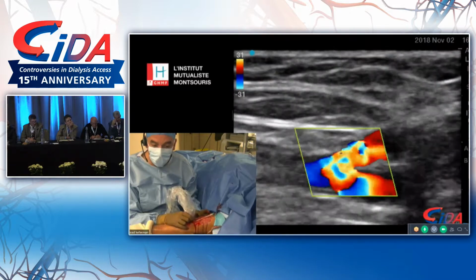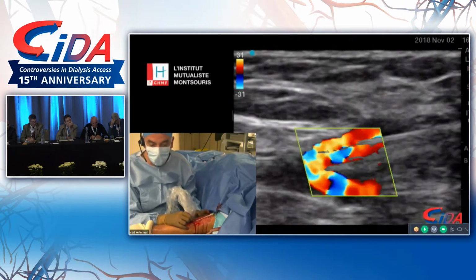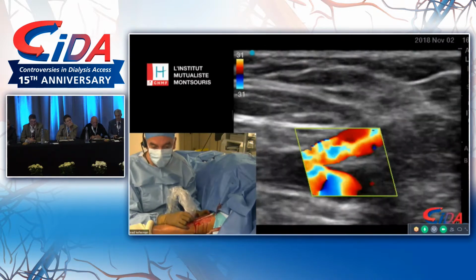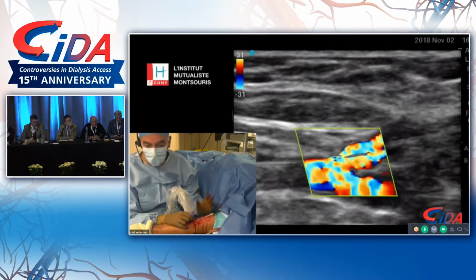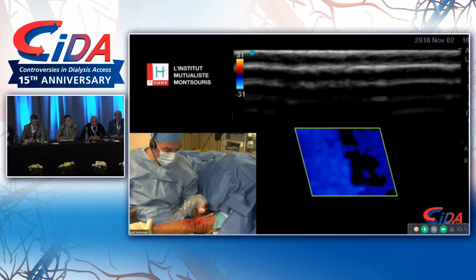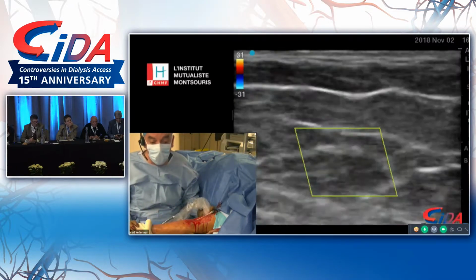So we didn't have any issues with even the most calcified artery you can imagine. I remember I did a patient with previous finger amputation, horribly calcified arteries, and we were able to treat it. So I'm not saying see a patient with a calcified artery and party about it, but I don't think it's a horrible problem to have when you are going to do this procedure.